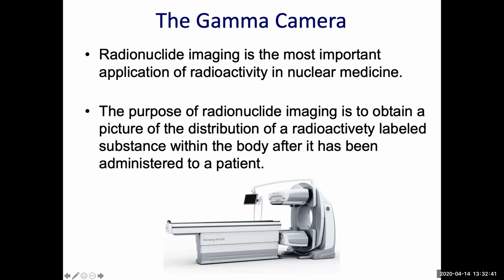And this is an example of the gamma camera used in different departments. This is the GE camera with two head detectors, and this is the table. So these detectors are detecting radiation, not emitting radiation. Okay, and sometimes it is combined with CT here for localization and attenuation correction.